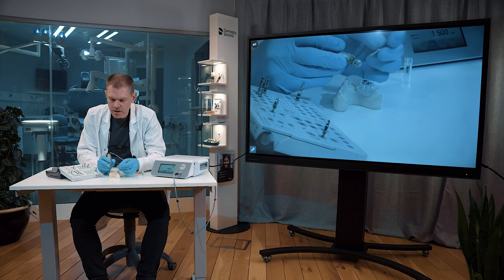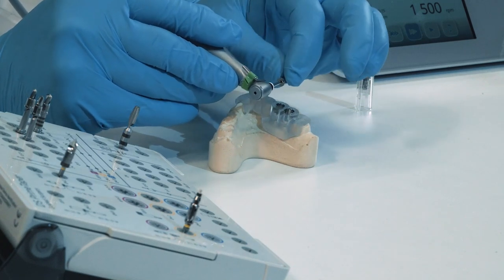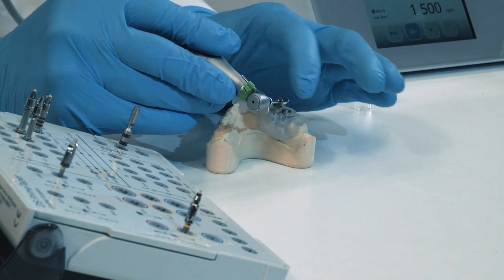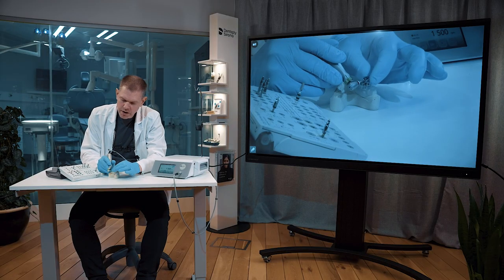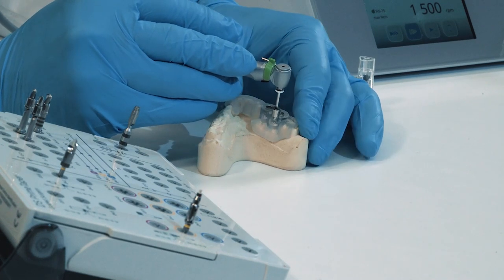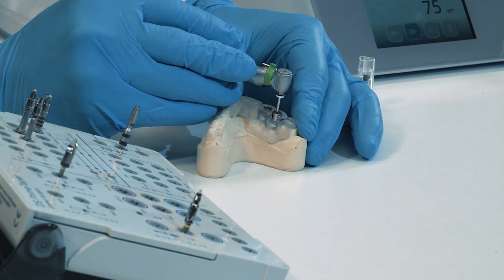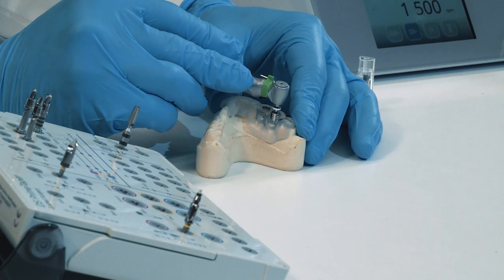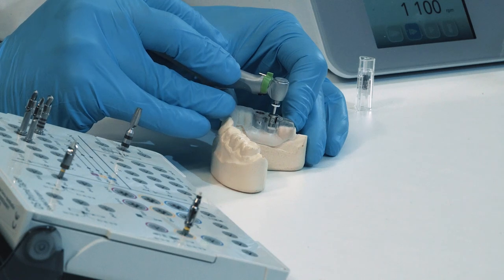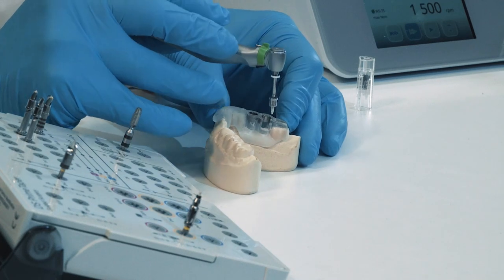Now we come to the drills which have a sleeve on, like a drill stop. You must be very careful to seat this sleeve at the specific position on the drilled portion — you can find a little dip, and you feel very clearly that it is seated in the correct position. Then you go in laterally from the side, put it in the starting position, and start drilling all the way down. Carefully go up, still drilling, put a little pressure from the side, and when back in the final starting position, take the drill out.